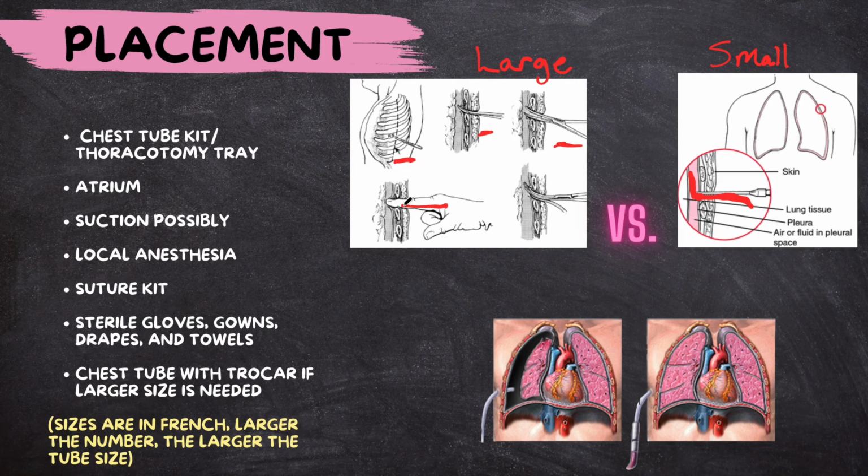Now, look at the pictures on the bottom. This kind of shows you where your tube comes in, and we'll just call this a pneumo here because it looks like airspace. And look how much more collapsed that lung is there. Now, a lot of times when they put a tube in for a pneumo, you can hear a gush of air coming out as they get it in. And it almost sounds like opening a soda pop bottle. You just have that initial rush of air.